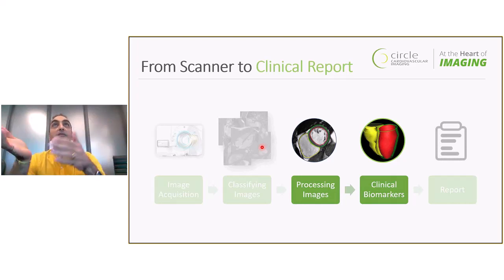So as I mentioned before, we have different types of images. We have perfusion images and we have function images, which are divided into the short axis, long axis views and so on. And in order to be able to extract the correct biomarkers, each image needs to be subject to different types of processing. For example, let's focus on function. In order to be able to analyze the function of the heart, we need to start delineating different structures inside these function images. So before talking about image processing techniques that we have to apply to these function images, I would like to talk a little bit about the biomarkers that we want to extract from these. So let's start with that one.